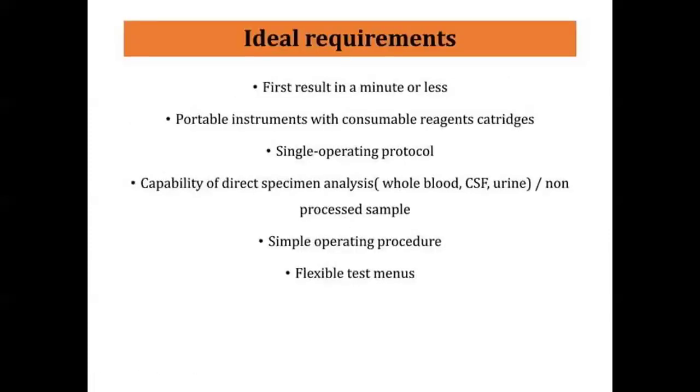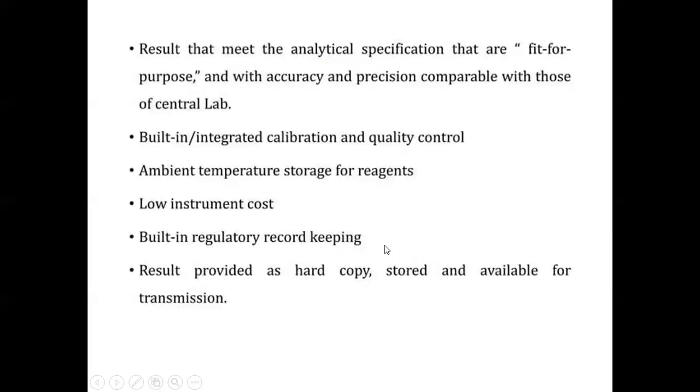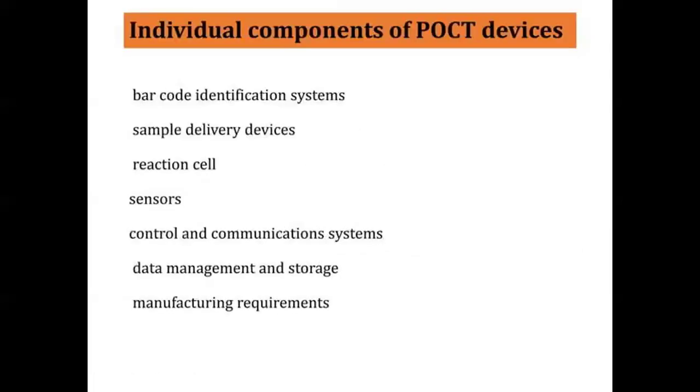And the ideal requirements are that the result should be very fast, very specific, and it should work according to the protocol. And the analysis, like blood and urine, should be done properly, and the results should be communicated. So let's go to the individual components that are present. There are a lot of components. As I told you, in the further classes, I'll be explaining how the microfluidic channel looks and how the analysis can be done.